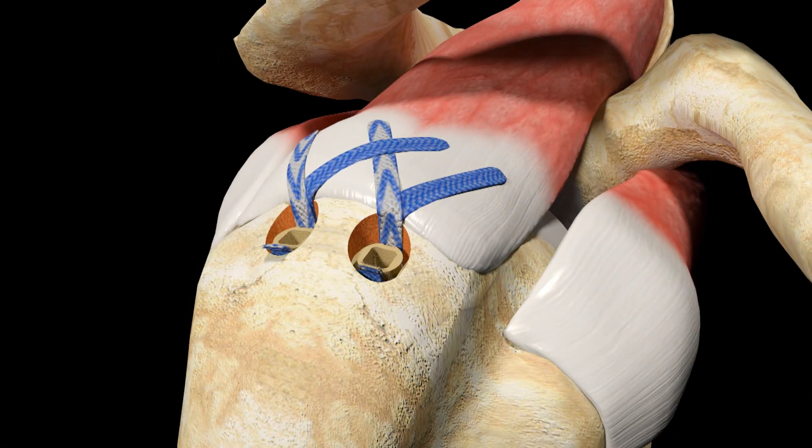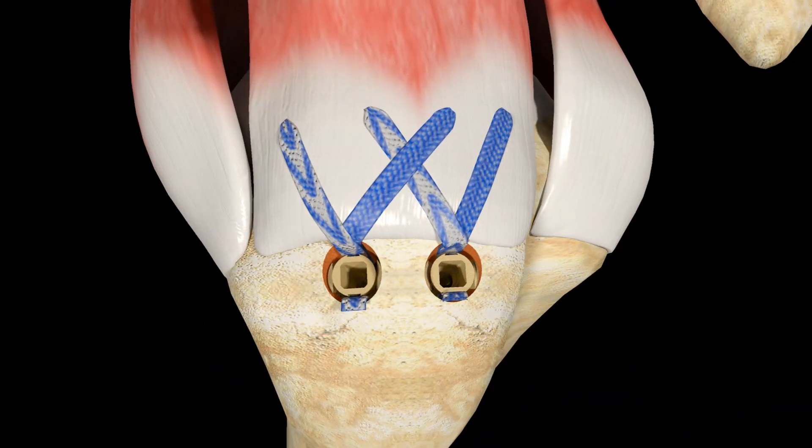Repeat the previous sequence of steps, locking the remaining free limbs of Ultra Tape into a second Footprint Ultra PK suture anchor to complete the repair.